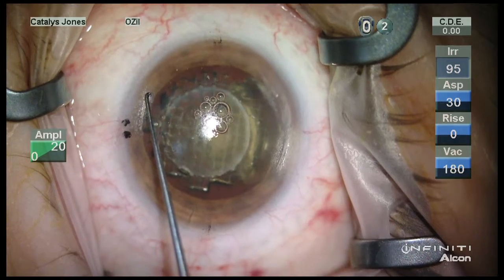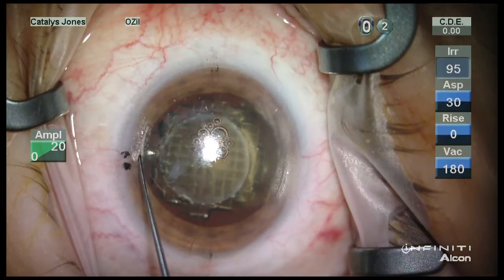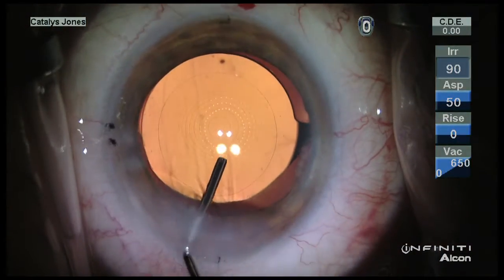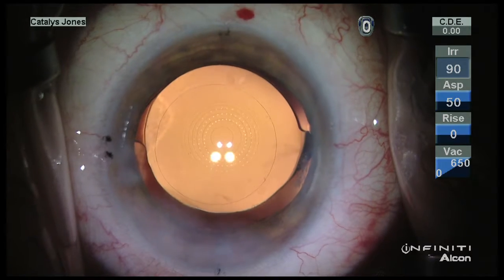And they are located here with the Sinskey and opened. Not only are the marks durable from the beginning, but they also last all the way to the end of the case, as you can see here.